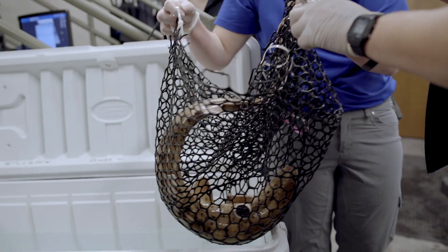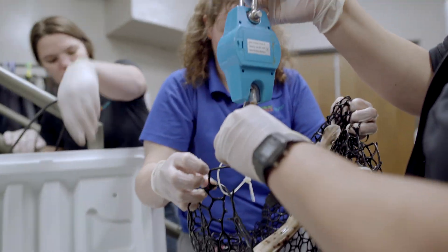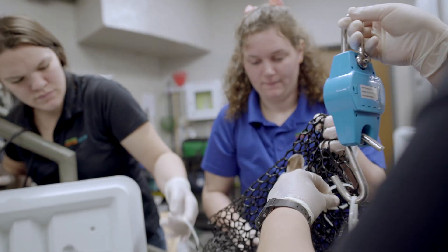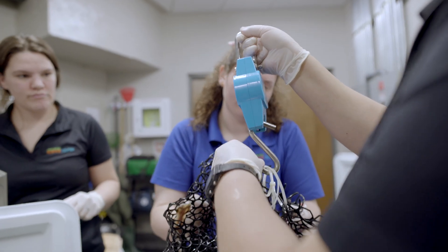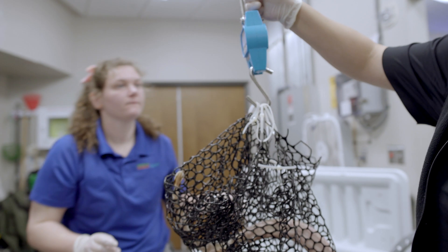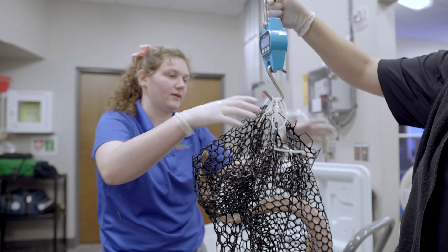When we move that shark from the anesthetic tank to the recovery tank, we use that time to get a weight on the animal. That involves placing the shark in a specialized net and using a hanging scale, and we do that in transport so we limit the time the shark is out of the water.